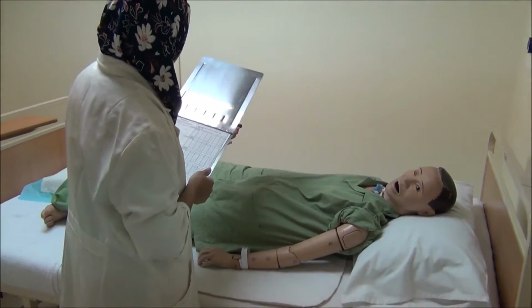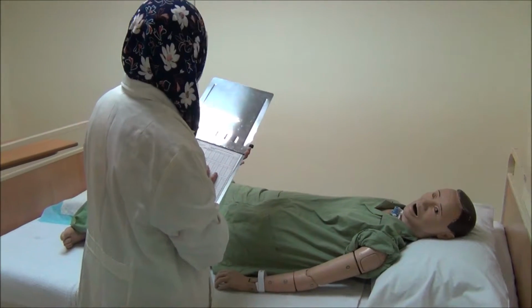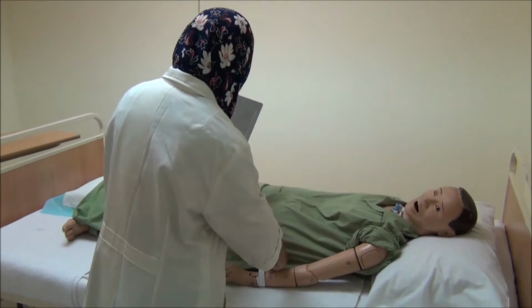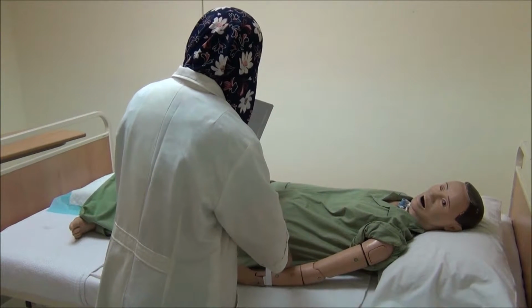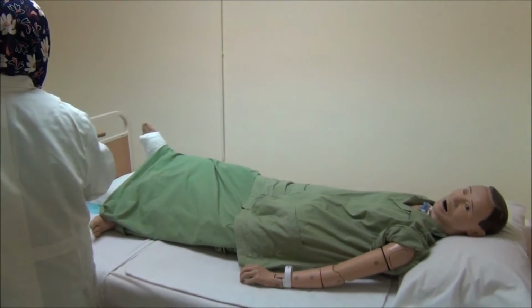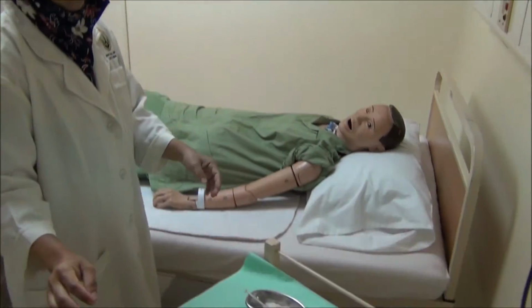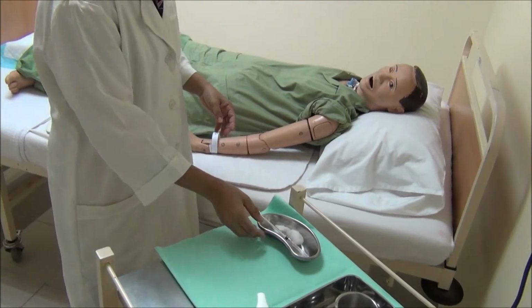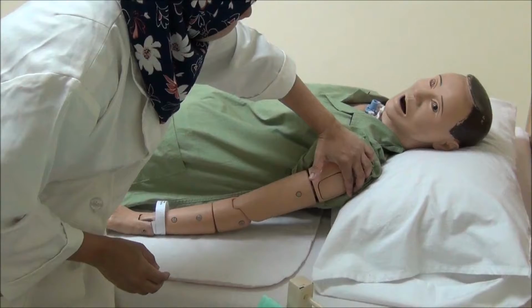Okay, mister. Now I want to give insulin injection. Again, may I know your name, please? Mr. Nick. Check the ID. ID band, Mr. Nick. MRI number 8910. 8910. See, she has confirmed with the right patient again. She has also located the site. And now, cleanse site with alcohol swab.